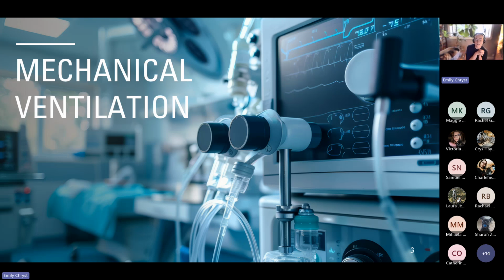Starting with why is mechanical ventilation so special? Well, contrary to the anesthetic ventilator, and just like high flow, if you're familiar with high flow oxygen therapy, we can adjust the oxygen level and provide humidified air with a ventilator. That's different than an anesthetic machine. We also, with the ventilator specifically, get to set a lot of parameters to control the type of breath a patient receives and get information on the patient's pulmonary dynamics. So this is definitely a big step up from high flow and is typically, now that high flow is available, going to be reserved for the most critical of the critical.